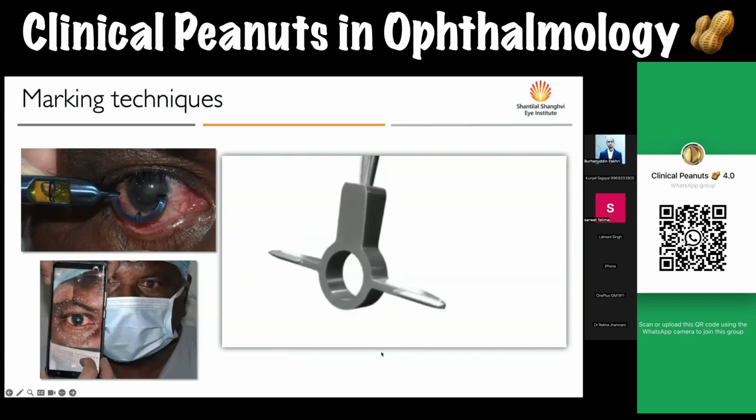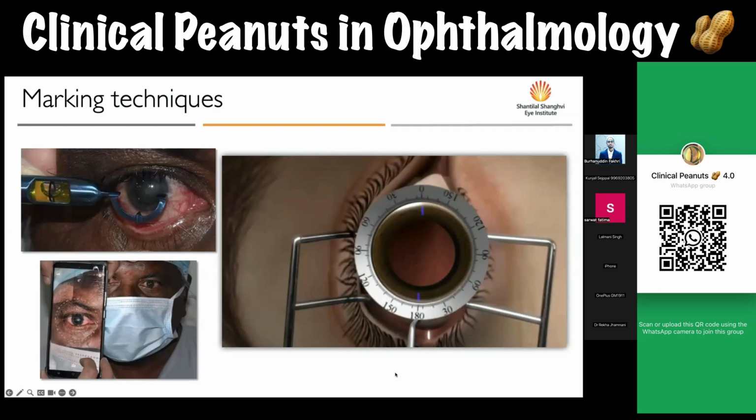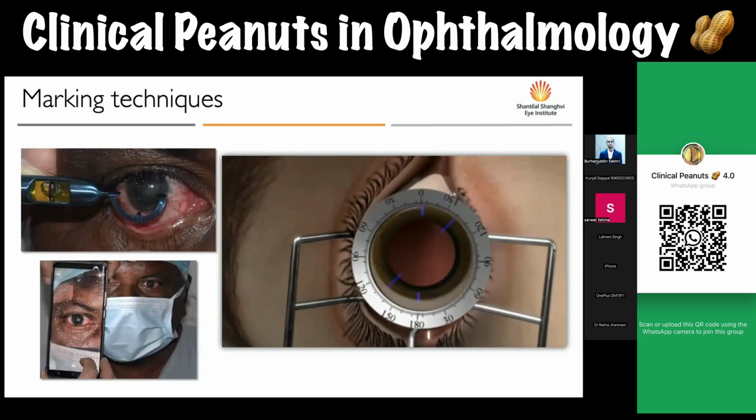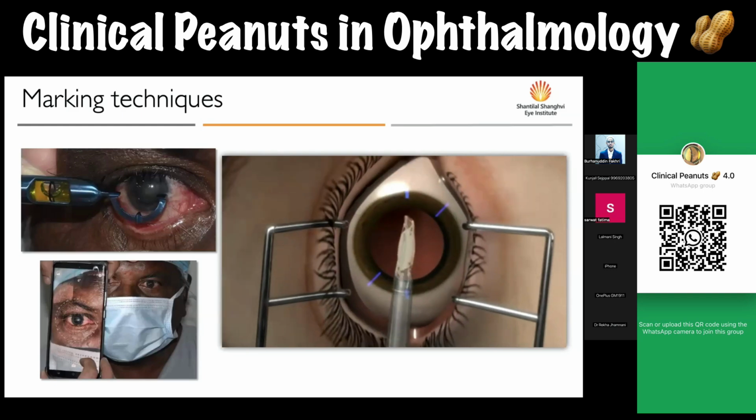Surgeon stains the axis marker using sterile marker pen, puts the degree gauge matching the rest points on marked 0 to 180 degrees, and marks intended axis of placement by producing 2 linear ink marks at 180 degrees each other. IOLs are inserted in the capsular bag using disposable delivery system, keeping the lens about 20 to 25 degrees away from final intended axis placement marks.